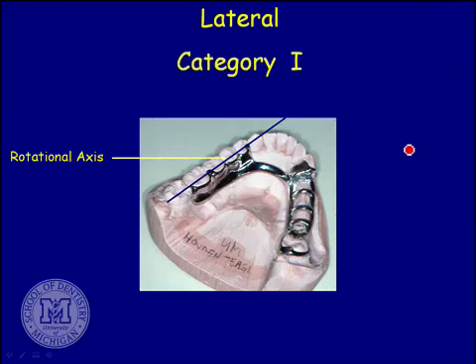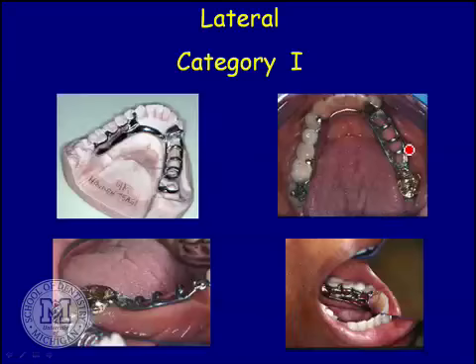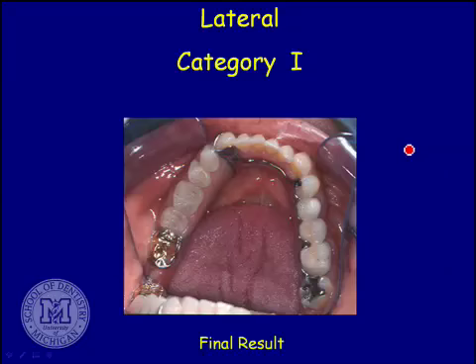Another lateral. It's got a longer span, same thing. You've got sort of a long span here. You can look at this and rock across to the other side of the arch. And there's the thing going. So when you're looking at any case where you might think about using those, talk to your faculty and take a look at the case and decide whether rotational path is the way you want to go.